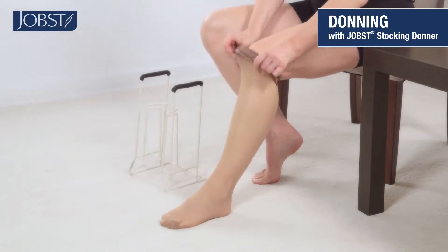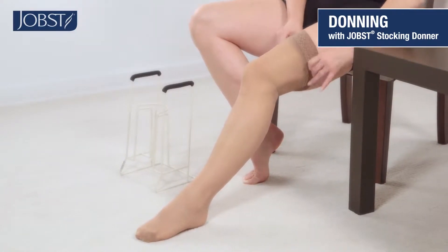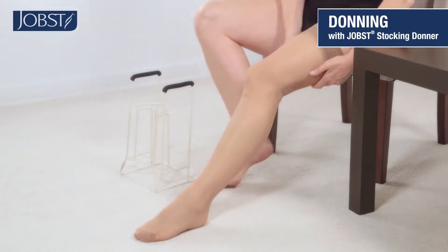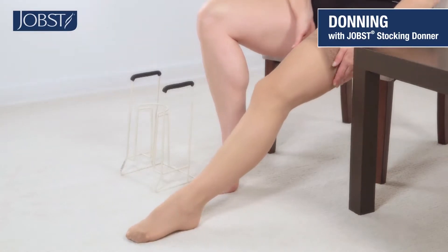Now you can go ahead and adjust your stocking. The gloves can help you do this, or you can just use your hands to gently pull upwards. Smooth the hosiery starting at your lower leg and working your way up until any folds are smoothed away.